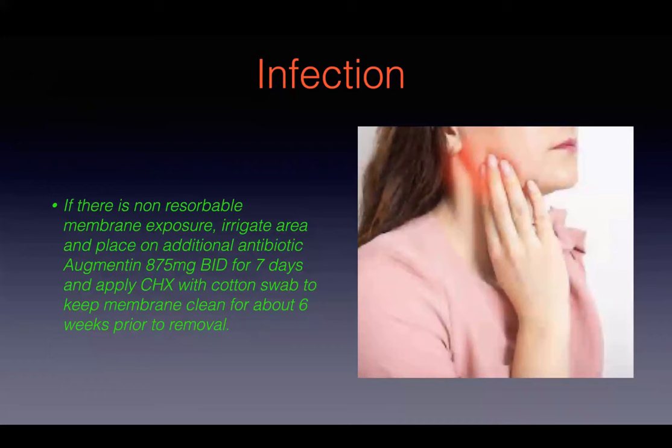Placed the 4 implants. These were placed in August 2018. And here's the 5-year post-op. The bone is stable. No bone loss.